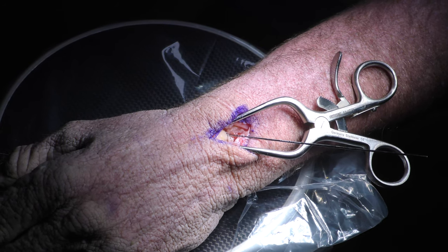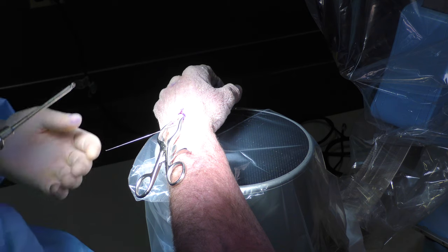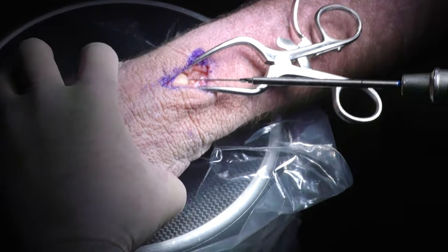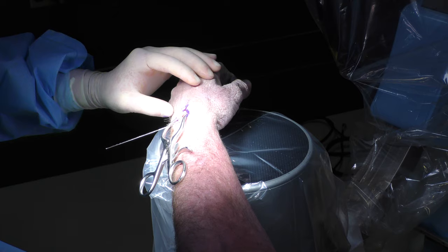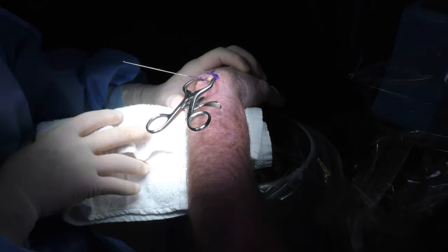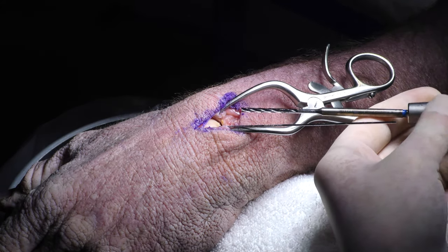And then we are going to drill. The first drill we use is the broach drill, and it slides over the wire. And it's just going to go through the cortex. And then we use the other drill, which has marks on it. You can see them, and it'll give you an idea.